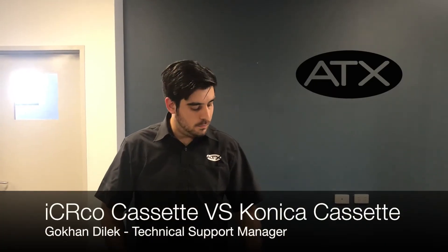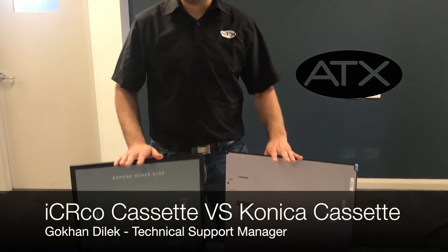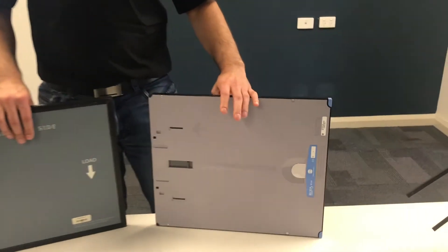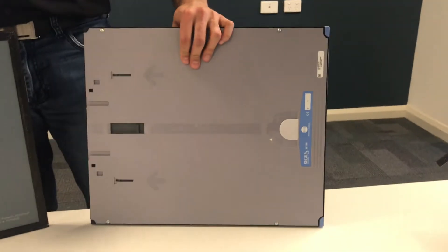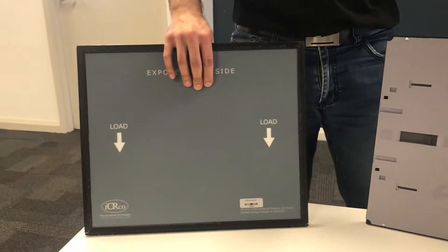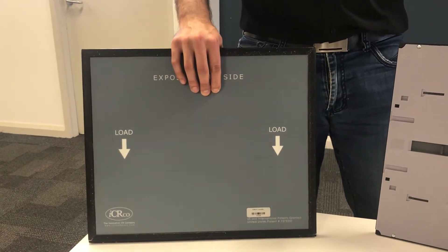Hey everybody, today I would like to talk about a few key differences between two different CR systems. On my left I've got a Konica Minolta Regius Sigma 2 cassette and on my right I've got an iCRco 3600 cassette.